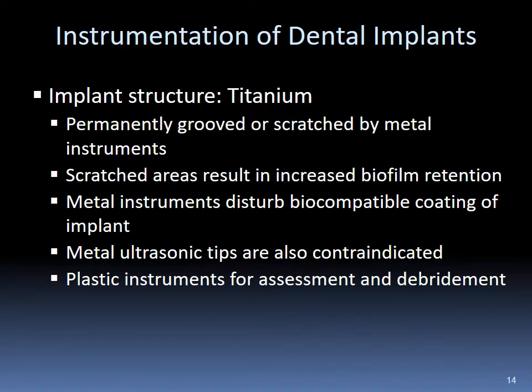The structure of the dental implant is titanium. This metal is soft and can be permanently scratched with metal instruments. It is believed that these scratches cause biofilm retention and disturb the biocompatibility of the coating on the implant. Metal ultrasonic tips are also contraindicated for use on implants. Only plastic instruments are recommended at this time for assessment and debridement, along with specially designed Cavitron tips.